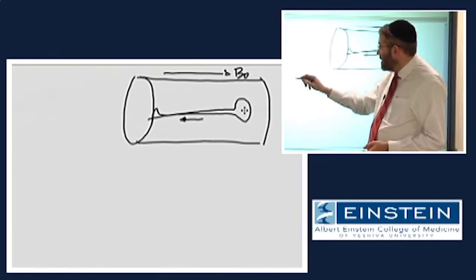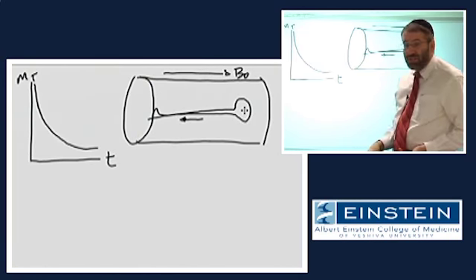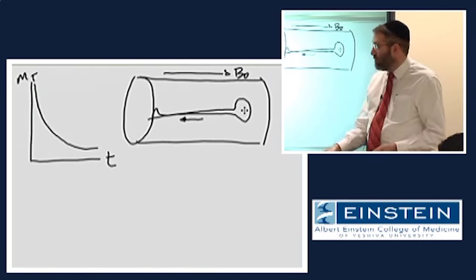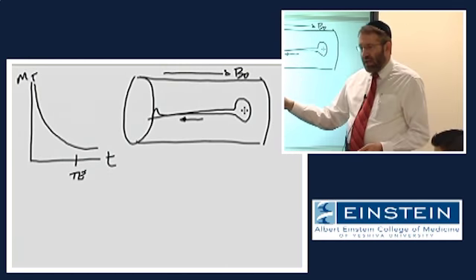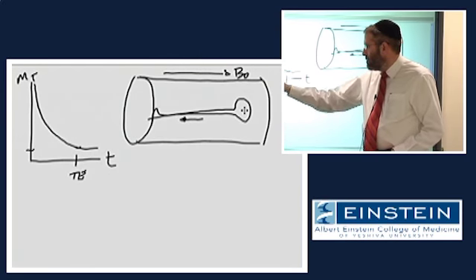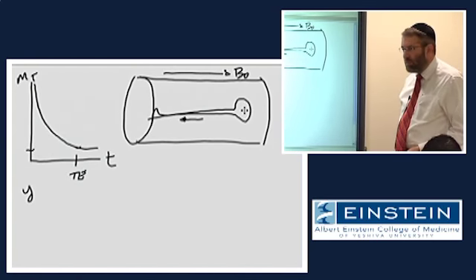And the signal amplitude changes over time, and that signal amplitude is a measure of how much transverse magnetization we have. And we choose some point TE to measure it at. So when I do that, and I get some measurement of signal amplitude, we have y units of signal amplitude, whatever it happens to be.